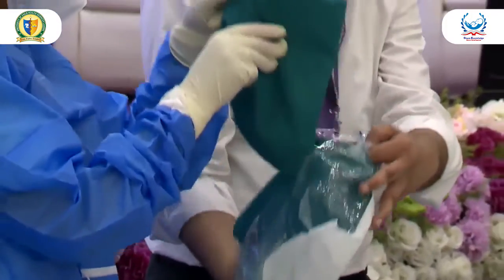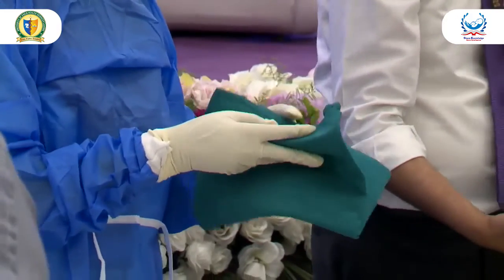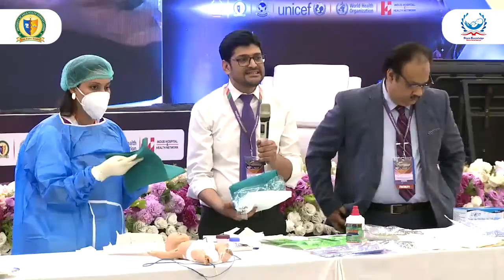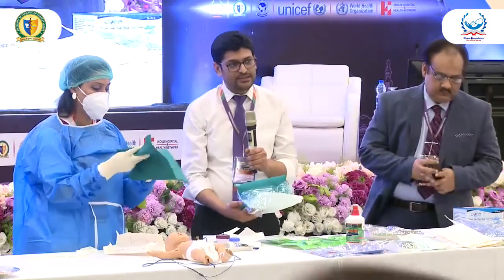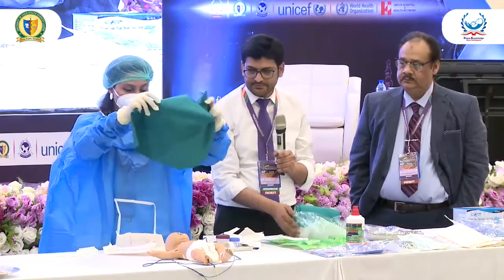Okay. Now we are about to get two sterile sheets. Now we are about to get sterile sheets with a central aperture to prepare the site of insertion.